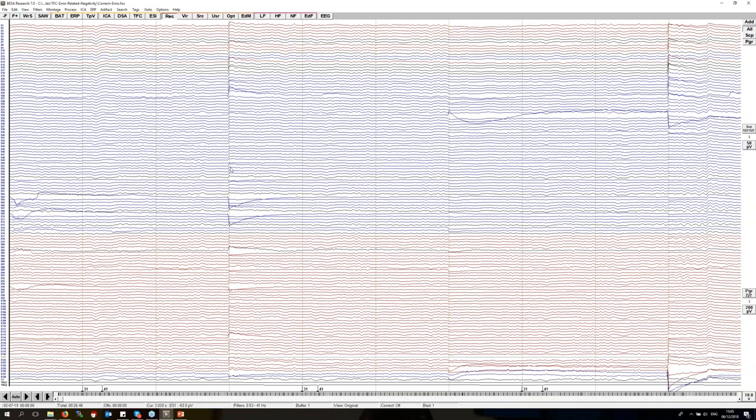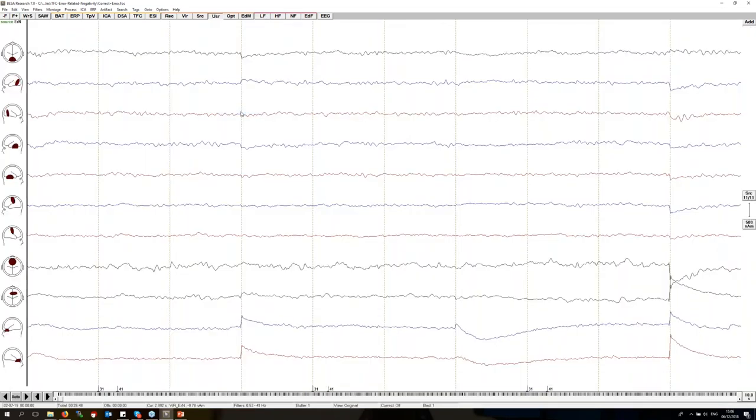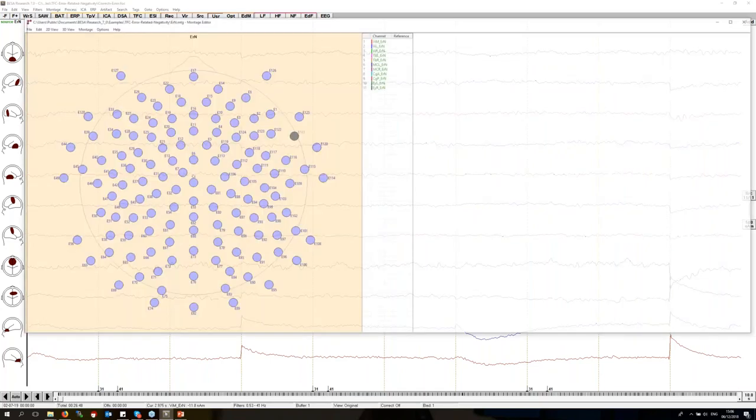And if I now look at the connectivity between 128 channels on the scalp, I will find a huge amount of connectivity. But the real effects will be masked by volume conduction effects. So I will first transform the signal into the brain using a brain source montage. This montage here, ERN, has 11 sources. To see where in the brain they are, I can use the Edit Montage button here, EDM, to bring up the display of that montage.